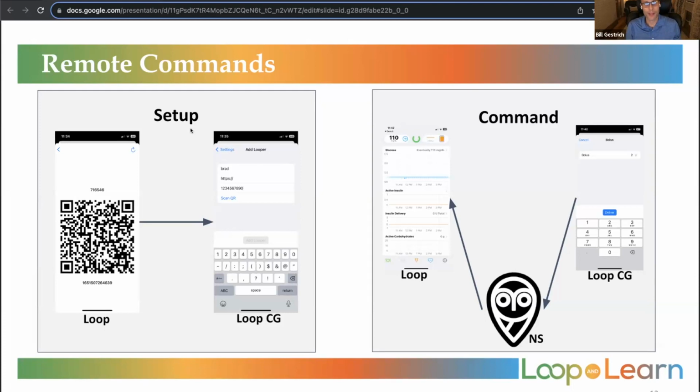And the reason that QR image is useful is that from it, we have an algorithm in the app from some third-party code where it can generate a 6-digit number every 30 seconds. From that QR image, we can generate a 6-digit number every 30 seconds.